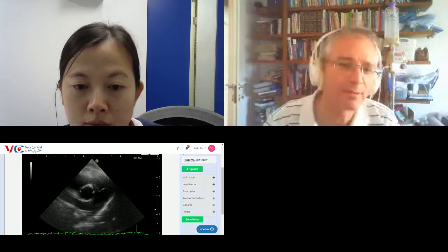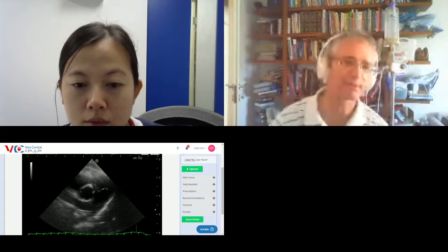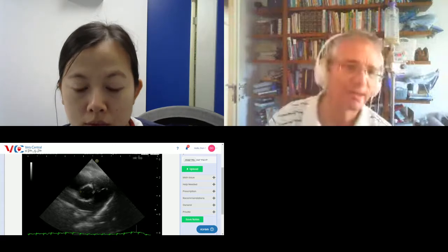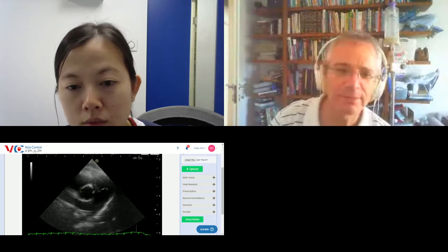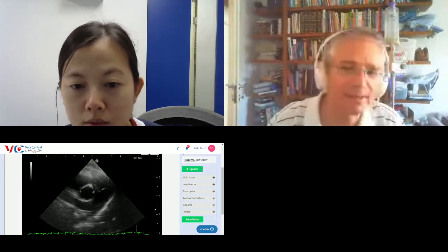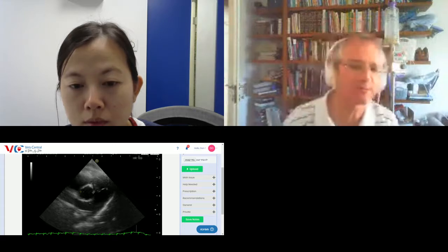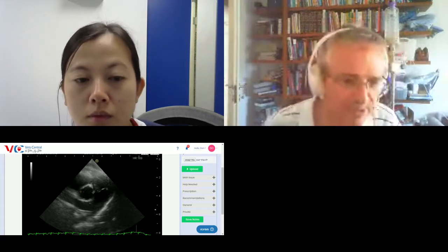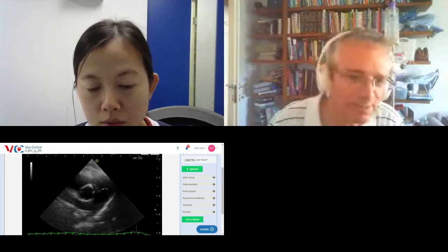So what I did right now was to emphasize the aortic root, when we are unable to see the aortic valve leaflets or cusps. This circle in the center of this image is the aortic root. To its right, where I annotate now, you see the pulmonary root, the pulmonary valve. And from here beyond, when you go this direction and that direction, these are the two pulmonary artery branches. The last one I annotated is the right branch, and the first one I annotated is the left branch.